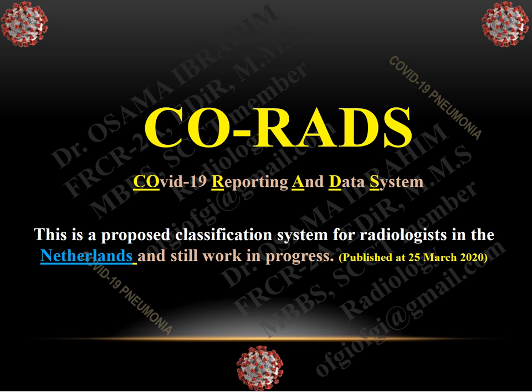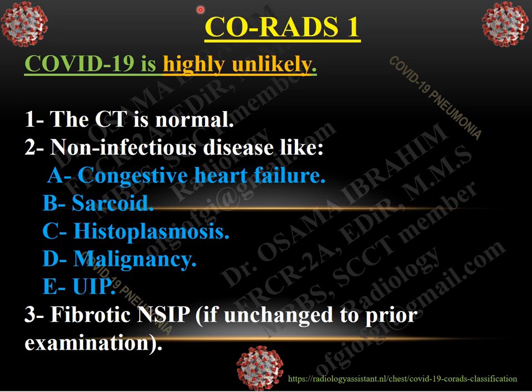Now, we'll talk about the main core of this presentation, the CO-RADS. CO-RADS means COVID-19 Reporting and Data System. This is a proposed classification system for radiologists in the Netherlands, still a work in progress, but it was published on 25 March 2020.